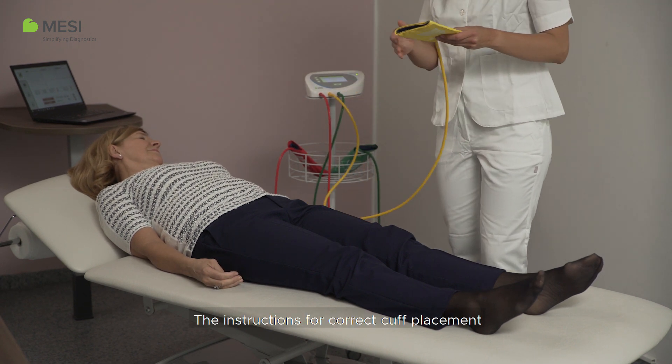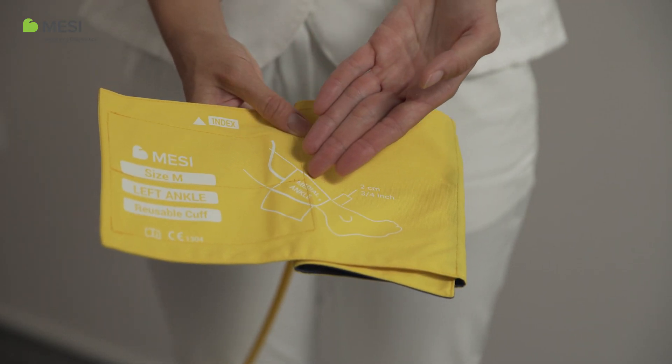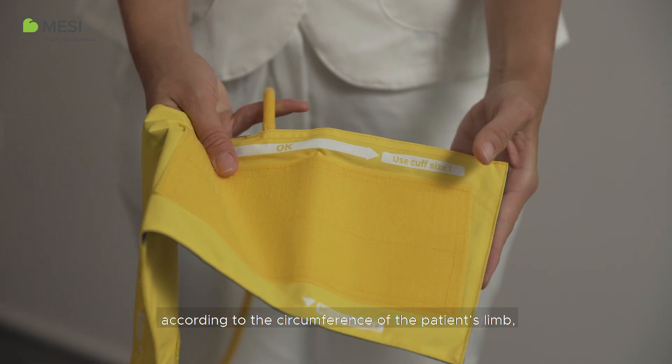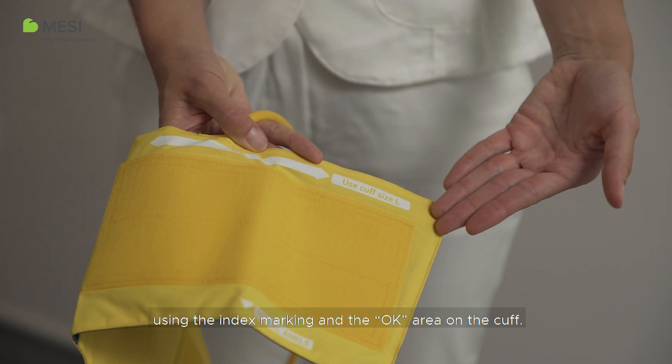The instructions for correct cuff placement are clearly marked on each cuff. Make sure to select the appropriate cuff size according to the circumference of the patient's limb using the index marking and the OK area on the cuff.